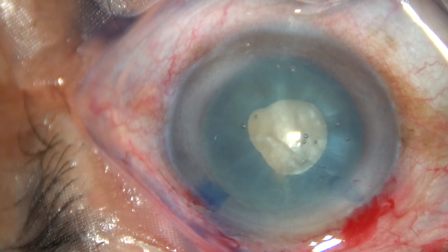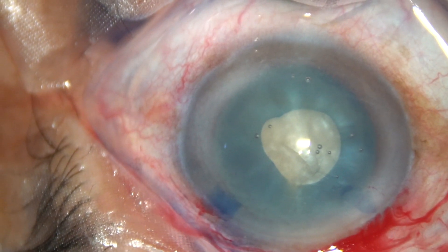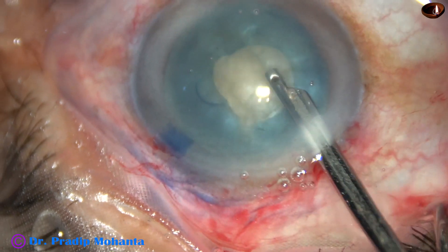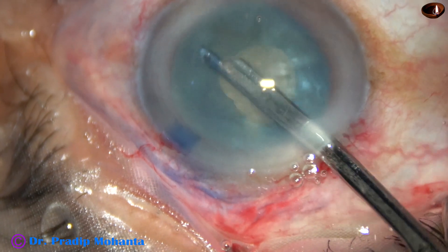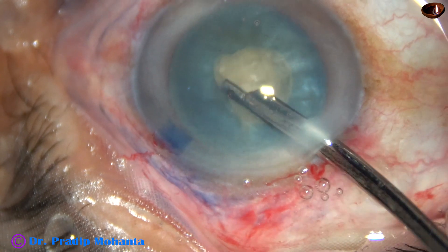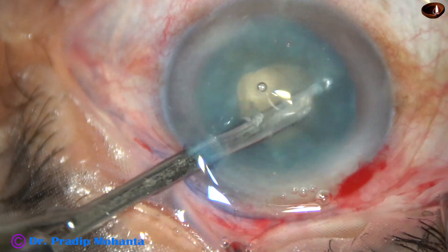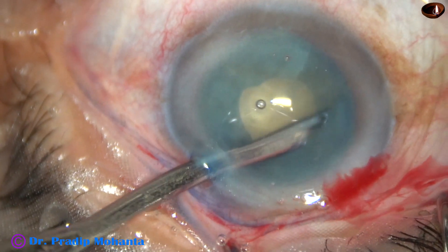This rexis need not be round, but it should be a continuous rexis, which will resist movement of the Simcoe or bimanual instruments while we remove some cortical lens matter. This is a 23G Simcoe. I am removing some cortical matter from 2 o'clock to 7 o'clock. Now I have gone through the side port, removing cortical matter from the remaining areas.